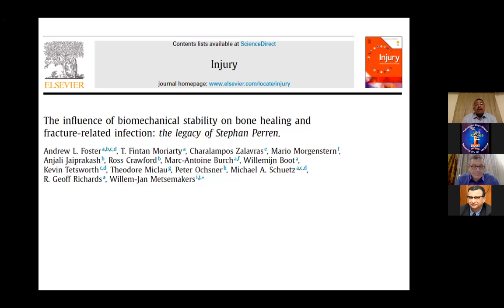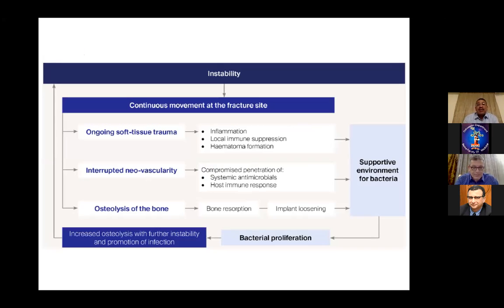Before I end my talk, I would like to emphasize the significance of stability, not only for bone healing, but also in fracture-related infection. If you have an open fracture, if you have an infected fracture, never leave the fracture without stability.